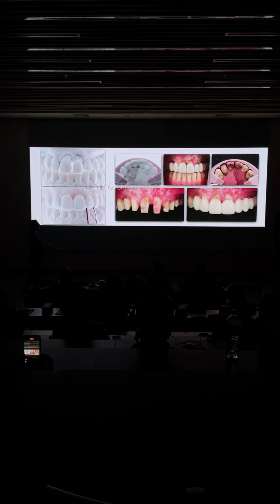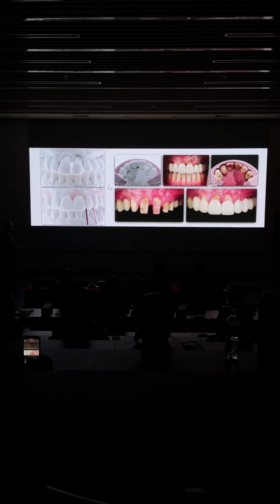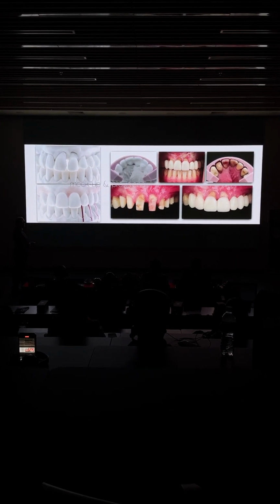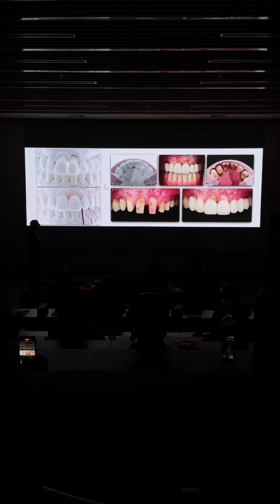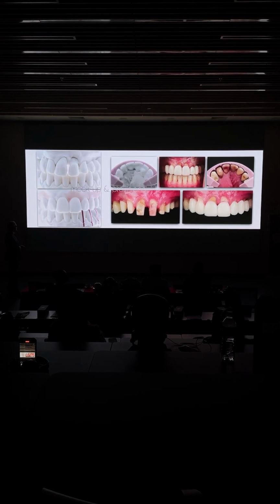Then I loved it. It was something that was possible for me. So what I did is I prepped the teeth. I placed some provisional abutments on the implants, and then had an idea how much I have to plump horizontally and vertically my soft tissue.